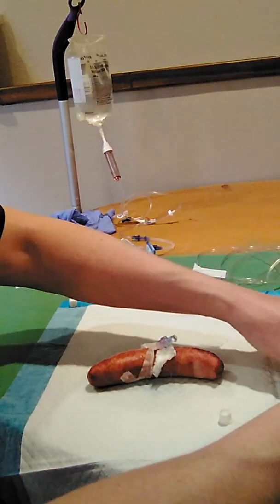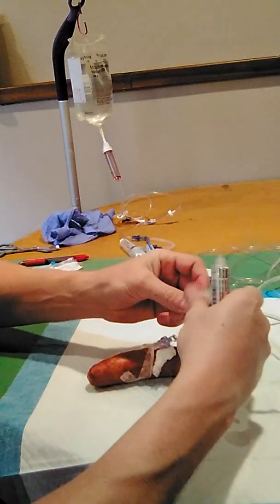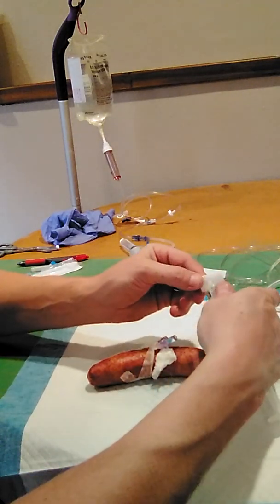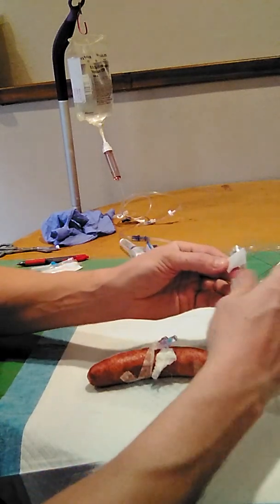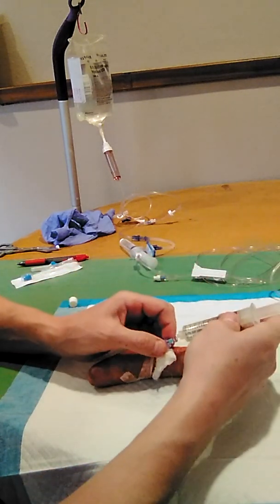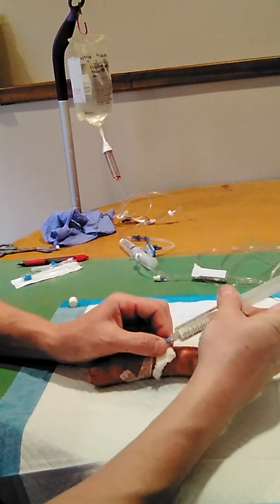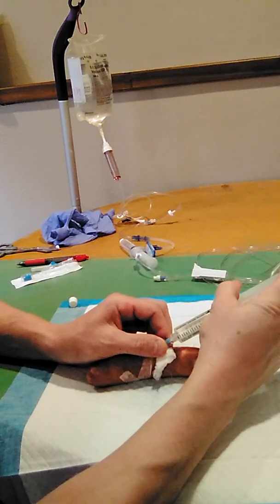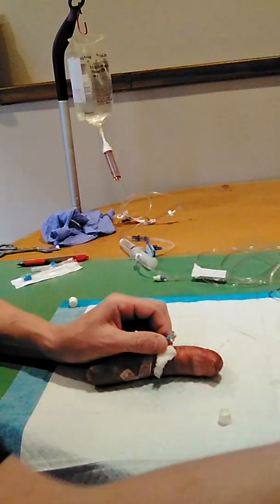So I'm going to open a new alcohol, and I'm going to clean this hub, allowing it to dry before I attempt to administer anything. Okay, I'm going to administer my 5 milliliters of saline flush. Okay, now that's performed. I'm going to set that aside.